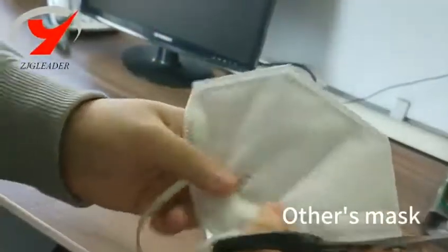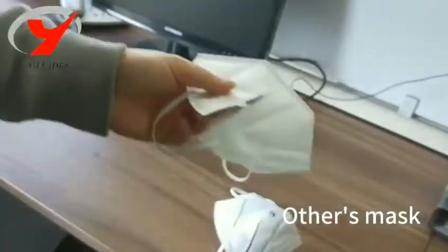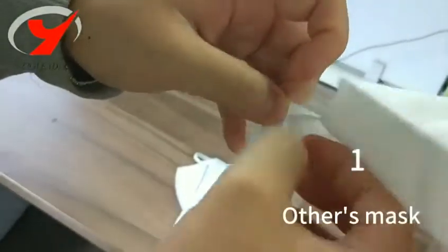This one is from another medical health company — have a look at the middle cut. You can see only three layers: one, two, three.